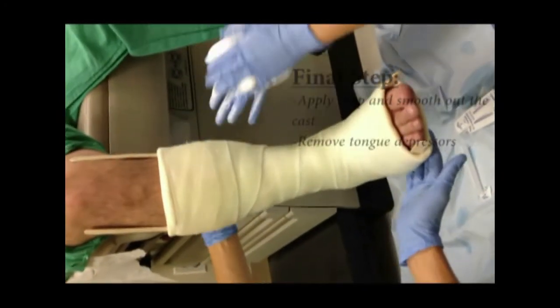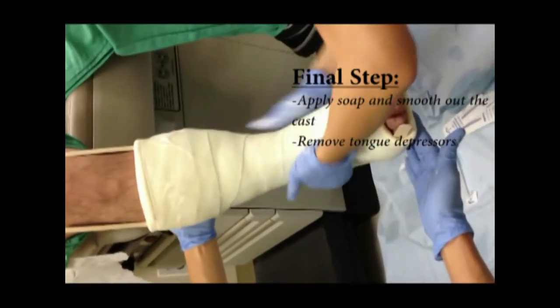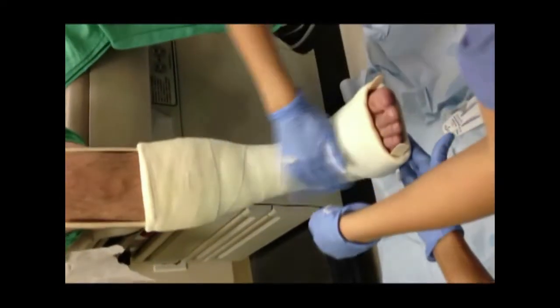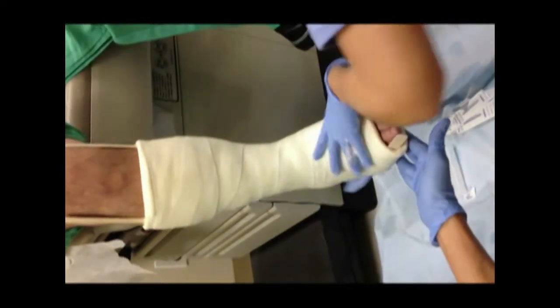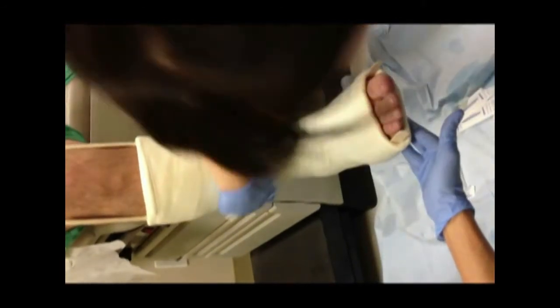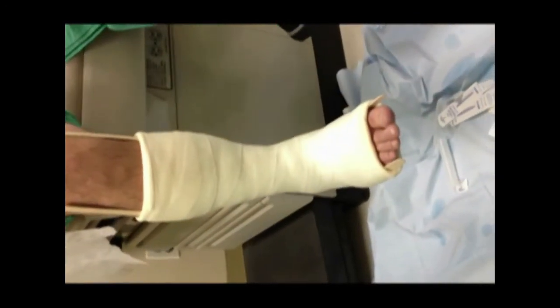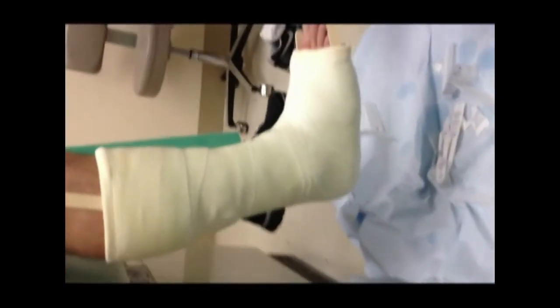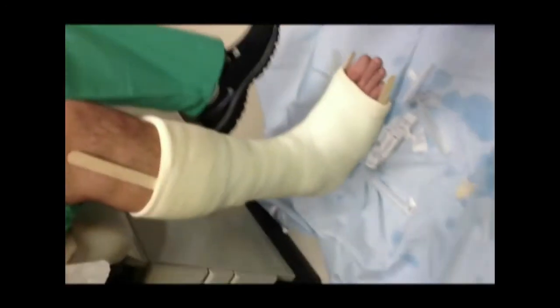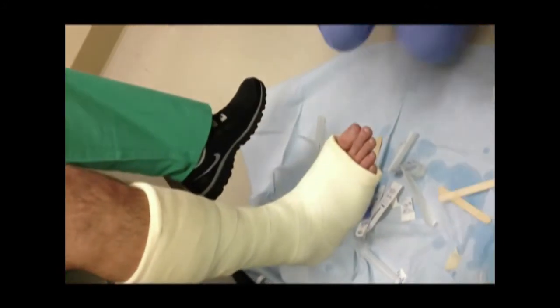The final step: soap on the hands and just rub it all over the cast. Smooth out the edges. If you want to take a look on the side, it still has the 90-degree angle that we were looking for. There you have it.